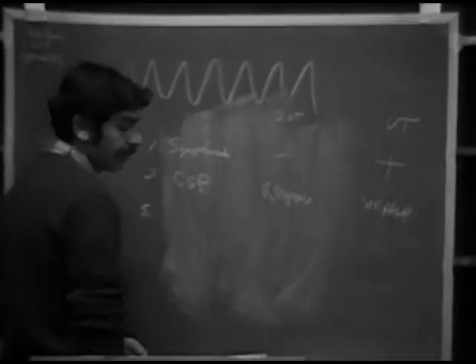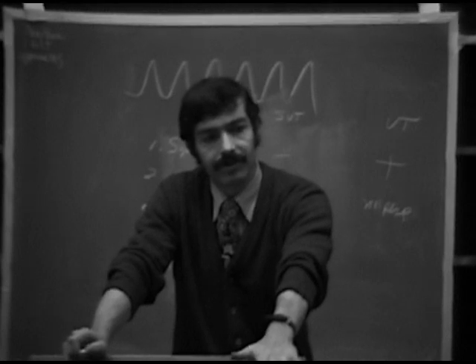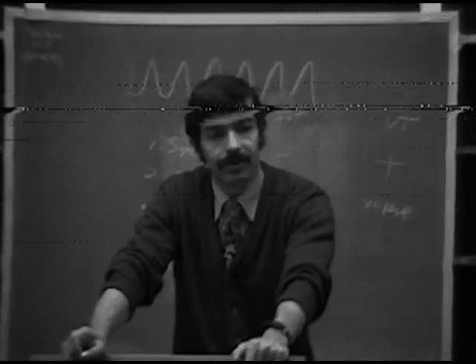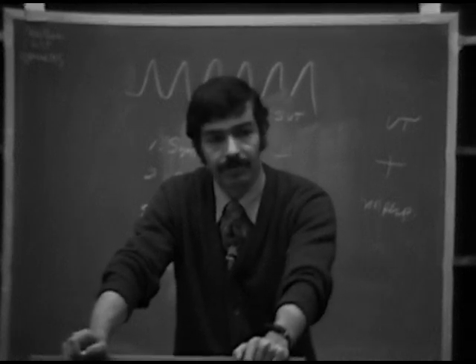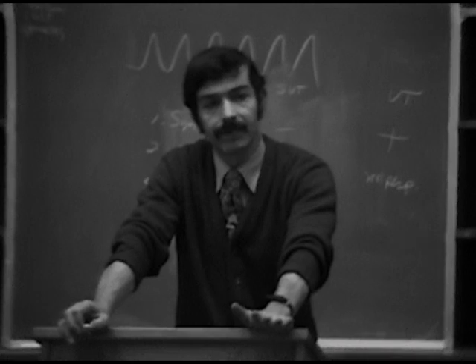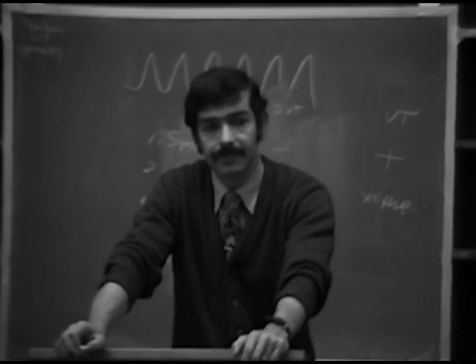Now, a third thing, what else can you do? Well, as we indicated before, when you're looking at supraventricular arrhythmias, you certainly want to look at the P-wave situation. In ventricular arrhythmias, you want to see the relationship of the P-waves to the QRS complex. So you go through the usual maneuver of looking for P-waves that we described previously. Just to review those, the first thing you do is take a full electrocardiogram and look at every lead, because in some lead that you might least suspect it in, you might see very nice P-waves. Right?